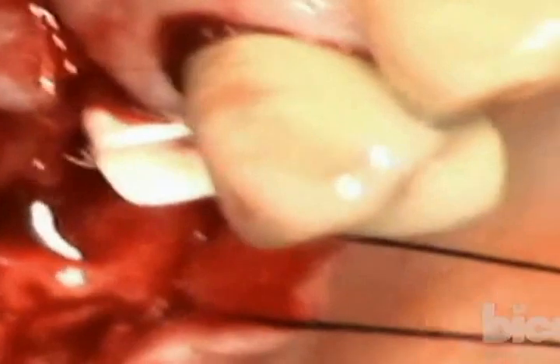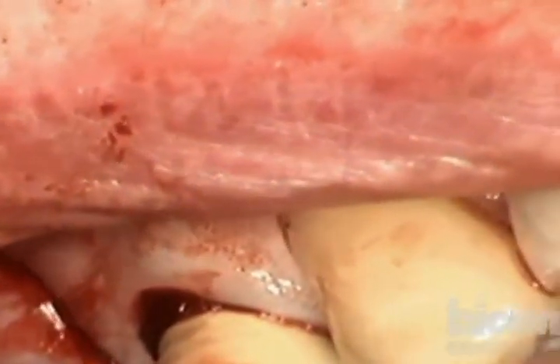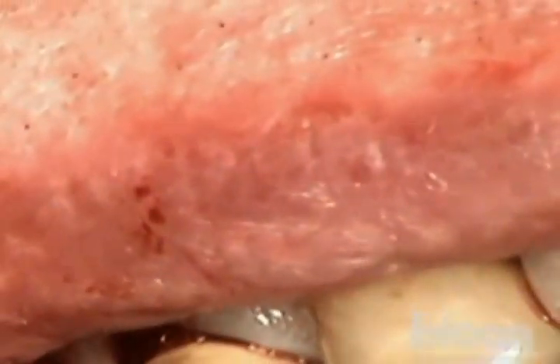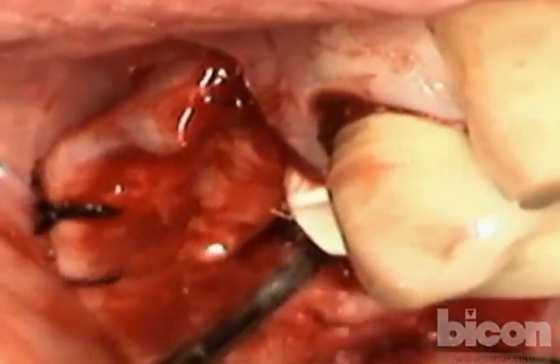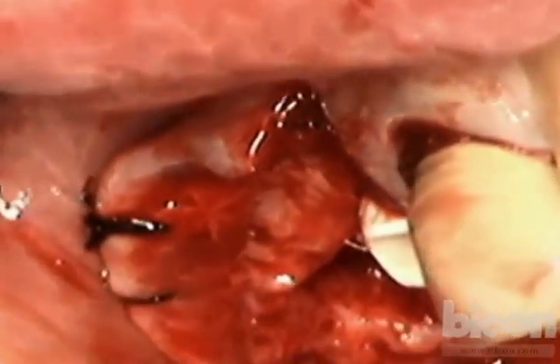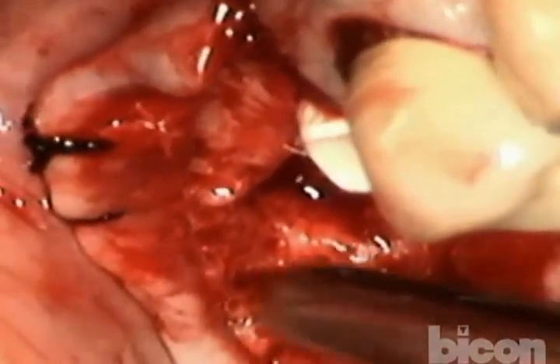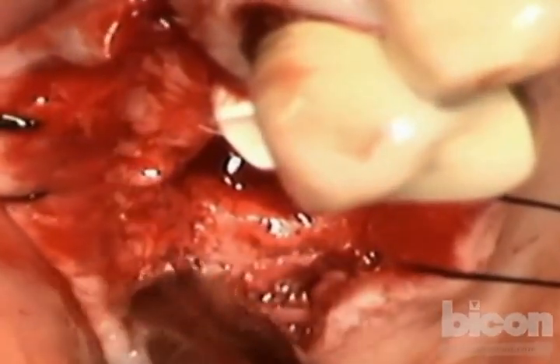Okay, so now we are finished with the sinus floor transport. We will go on to the sinus lift. I need the sinus lift curettes. You can go in and just make sure that your sinus mucosa is intact and that it's mobilized. The only thing I don't like is this corner, so I'll go after it with the smaller osteotome. Hold this. Thank you. Because that will be more selective as to the corner only.